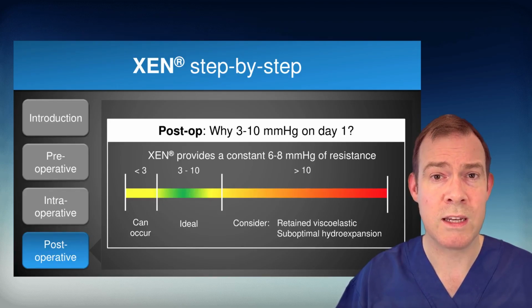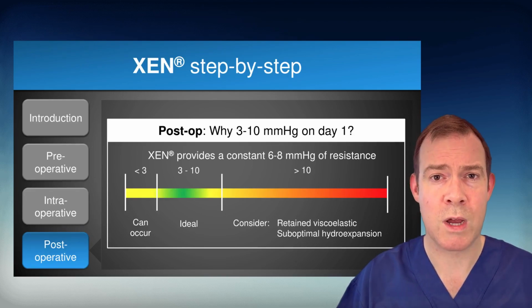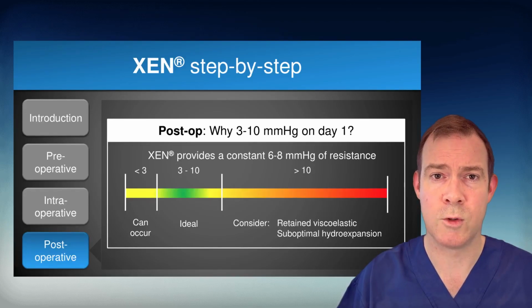Pressures less than 3 can be seen, often with no sequelae. But if the pressure is more than 10, we need to consider whether there's retained viscoelastic, or the XEN is occluded, perhaps by a strand of iris, or there's been insufficient hydroexpansion, or there's too much resistance in the subconjunctival space.